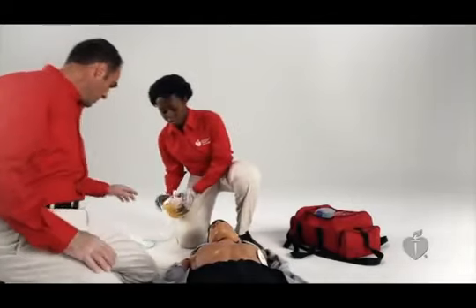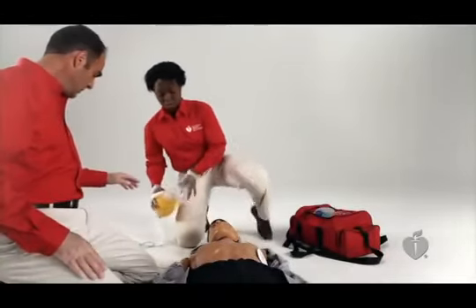The AED then tells you if a shock is needed. If the AED recommends a shock, it will tell you to clear the victim and push the shock button. Again, be sure no one is touching the victim to avoid injury to rescuers. Then loudly state a clear the victim message. It can be something like, "Everybody's clear," or simply, "Clear." Perform a visual check to ensure that no one is in contact with the victim.